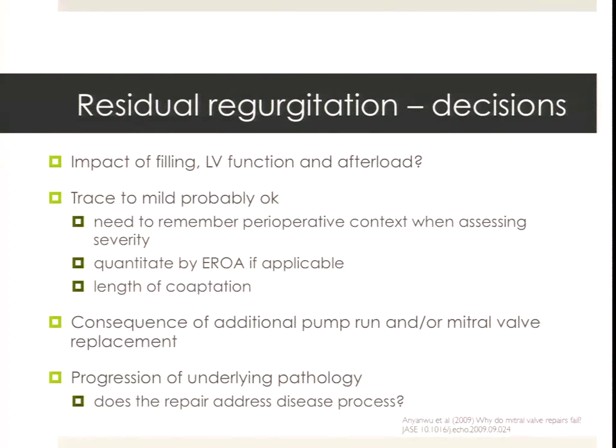So you have to put the disease process that you're looking at in the context of what you're doing when you're making these assessments, and you're relaying the information to the surgeon for them to make a decision about whether they're going to do another repair or not.